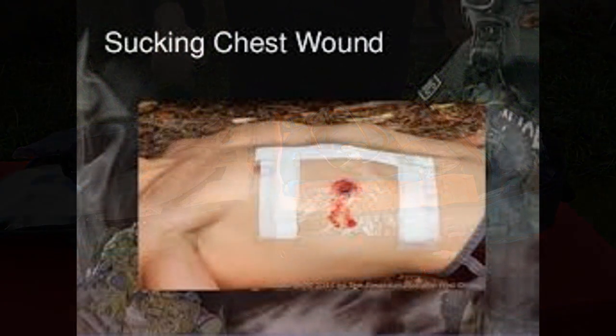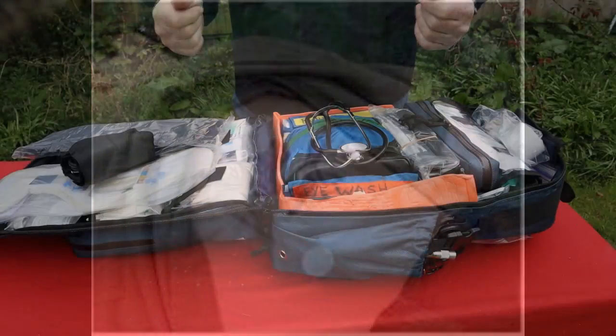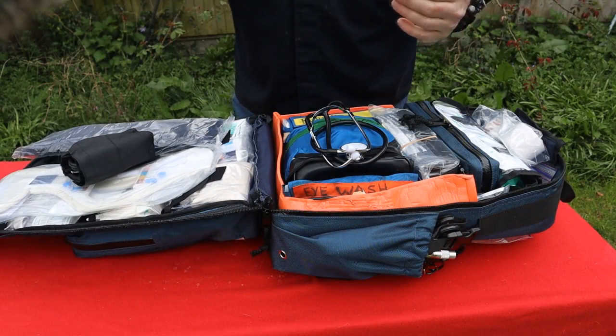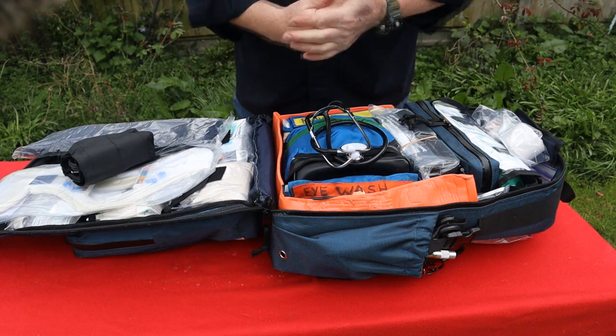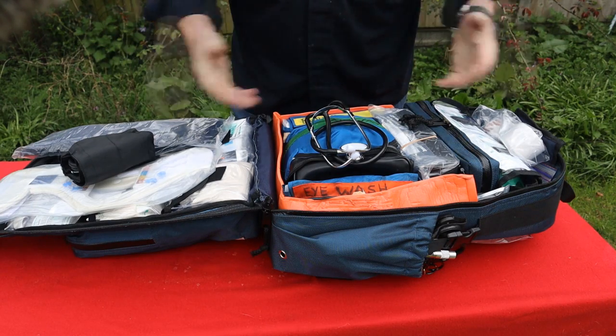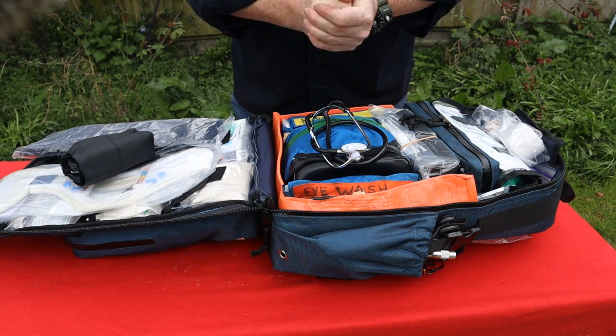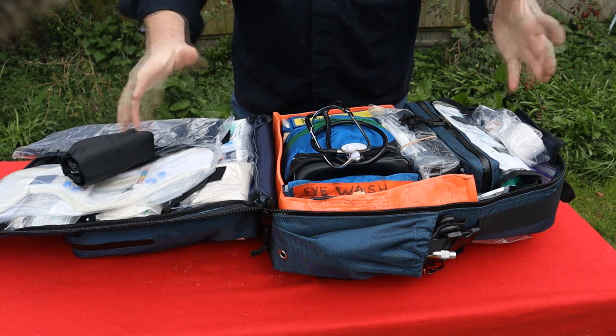If there's anything stuck in it, you've got to leave it in. There's no point packing a wound in the chest, because all that's going to happen is you're just going to push things into the heart, the lungs, the abdomen, and that's all going to be bad. So what we want to do is seal it. In my IFAC kit, I've got black tape. In here I've got chest seals and thorax seals, but that's what we're going to do with the chest.